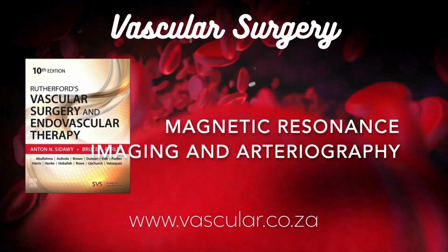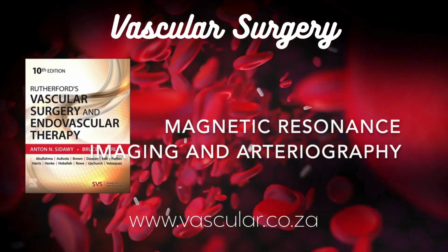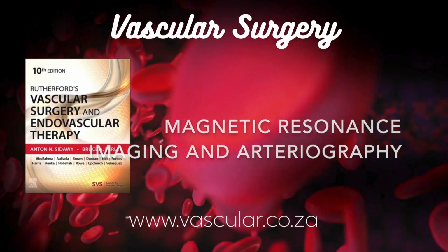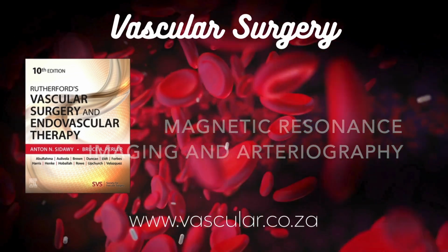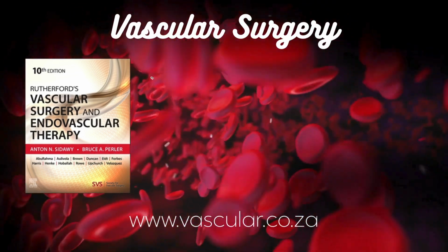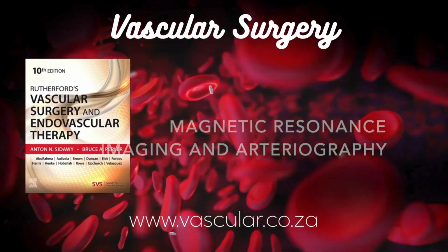Well, stronger magnets and better gradients generally mean potentially shorter scan times, higher spatial resolution, seeing finer details, and a better signal-to-noise ratio, which means clearer images. The faster computers just handle the complex data processing more quickly. The jump to 3T, for example, often gives a noticeable boost in image quality for MRA in many parts of the body.